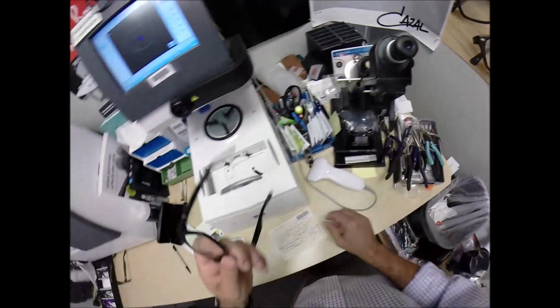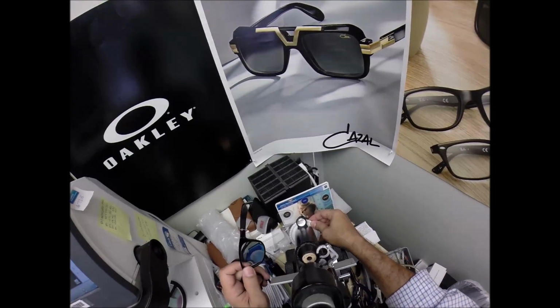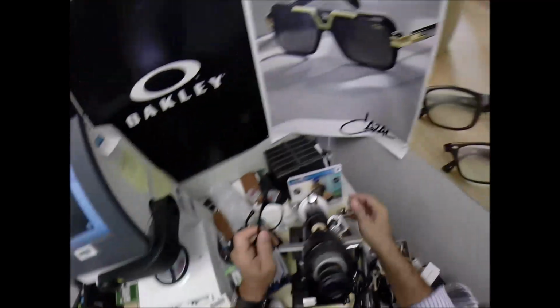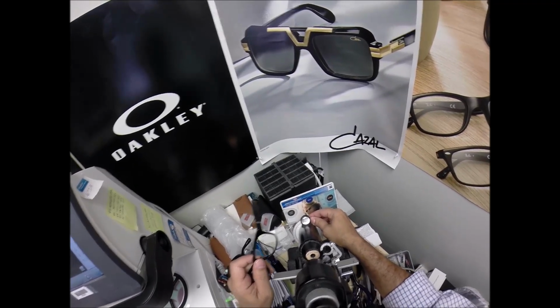But I'm going to turn the fine tune knob to 17, which corresponds to the axis of my left eye. We're going to put it on 17. And that's 117. Hang on, 17. Did I mention I went to college for this?